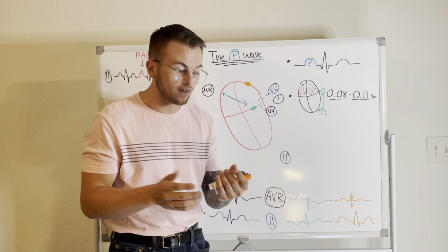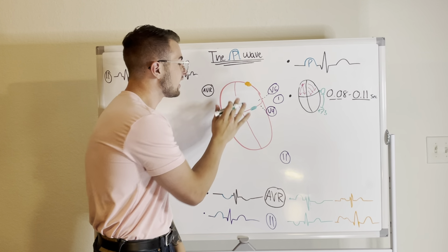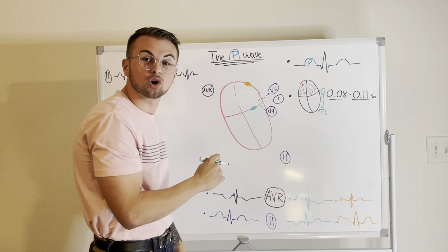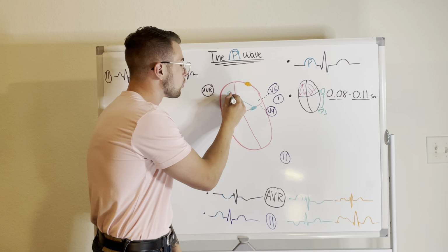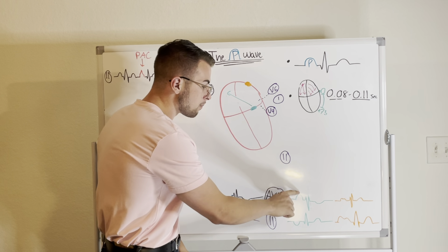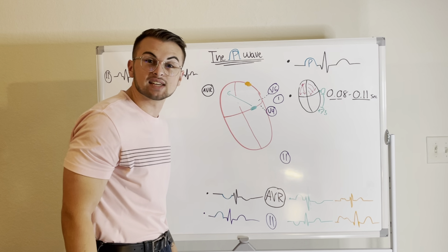Remember that morphology is simply how something looks. For example, if I told you that a particular heart had a dead SA node and instead it had a pacemaker bundle that was near the AV node. Now, what if I told you that this abnormal pacemaker bundle had an upward and rightward depolarization vector? You would tell me, of course, that the P wave would likely be positive in AVR and it would be negative in leads 1, 2, V4, and V6.